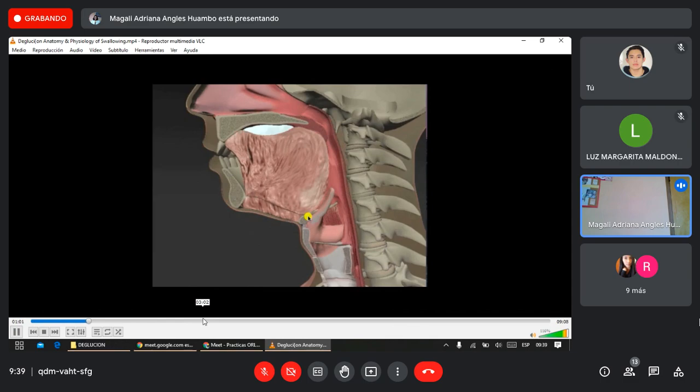So think deep, think 3 dimensions. This is your posterior pharyngeal wall, this pink fleshy mucosa in front of the spine. Then here is your epiglottis. The space between the lingual surface of the epiglottis and the base of the tongue is your vallecula. Okay, this would be the region of the thyrohyoid membrane, the thyrohyoid muscle, for example. Here you're looking at the thyroid cartilage, and this would be the region of, say, the ventricular or false vocal folds.